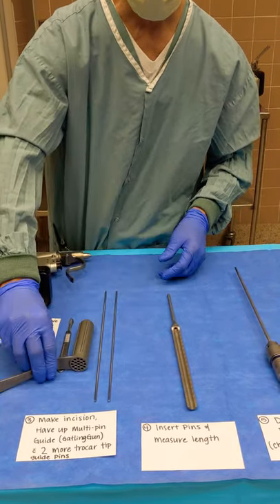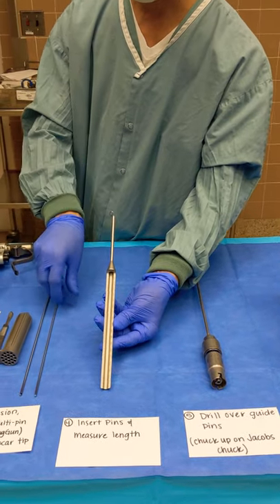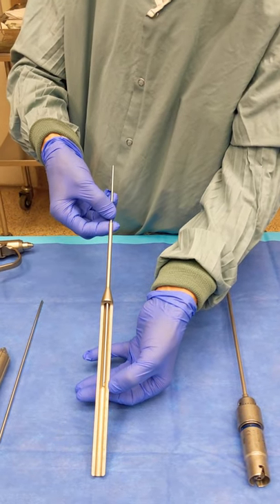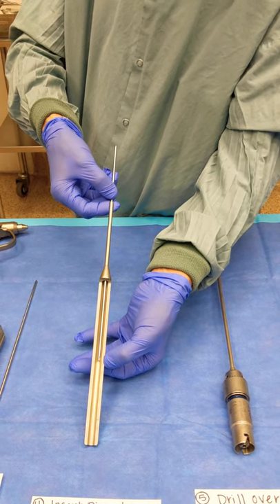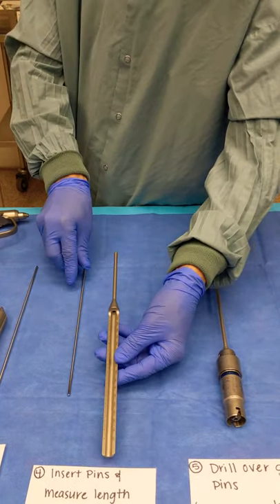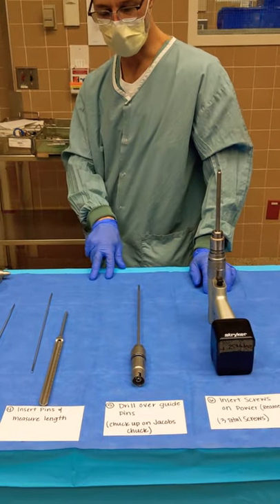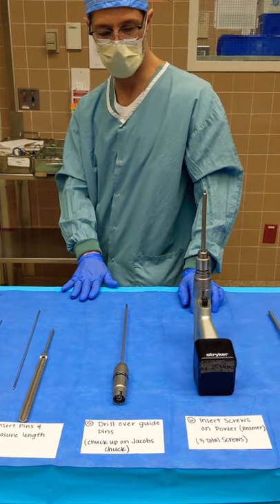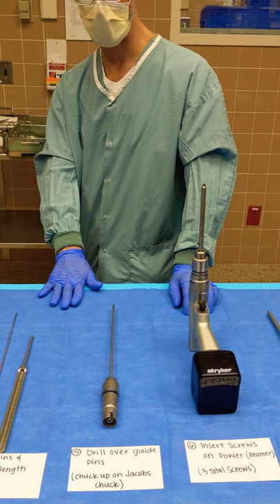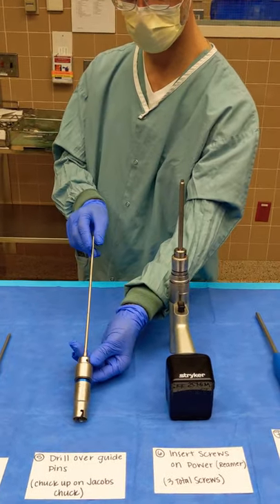Once they have all three pins in, we'll move to step four and find out what length screws we're going to need. We're going to use a depth gauge. These will slide over the pins that are in the hip, and you can read off the end of the depth gauge what screw length you'll need. They'll call that out — let's say a 100 millimeter length. They'll measure all three and tell you those lengths. You can write those down on your Mayo stand table and have those screws ready. Oftentimes you'll have two screw lengths that are the same and one that's a little bit longer.